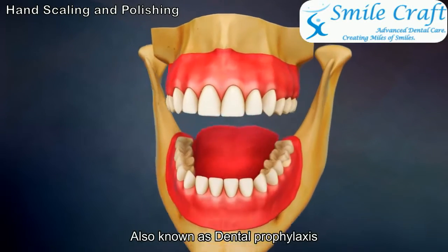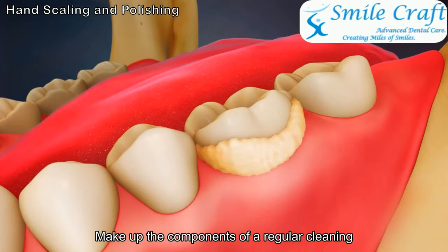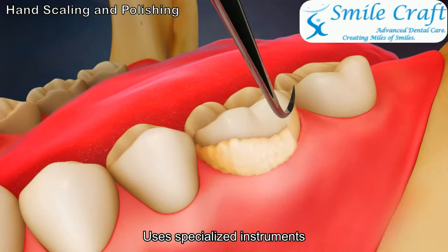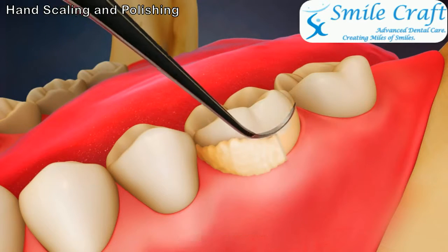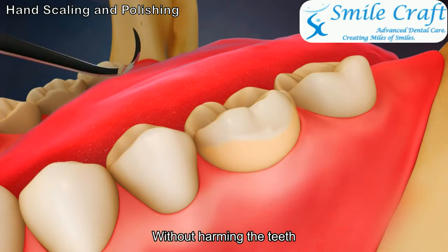Hand scaling and polishing, also known as dental prophylaxis, make up the components of regular cleaning. The dental hygienist or dentist uses specialized instruments to gently remove tartar that accumulates on teeth between cleaning visits without harming the teeth.